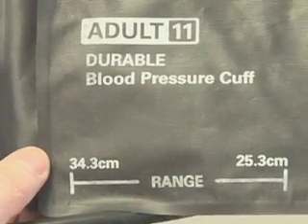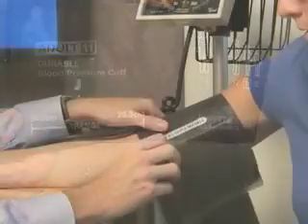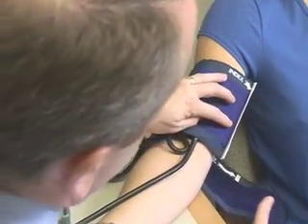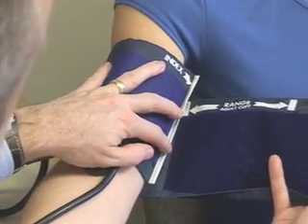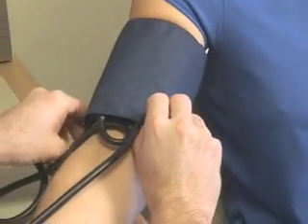Cuffs typically are marked with acceptable sizing indicators to facilitate proper fitting. However, it is more important to use a cuff that is appropriately sized for the arm. Cuffs should be marked with an index line that runs perpendicular to the length of the cuff and a range line that runs parallel to the length of the cuff. The index line should fall within the range line when the cuff is secured to the upper arm.